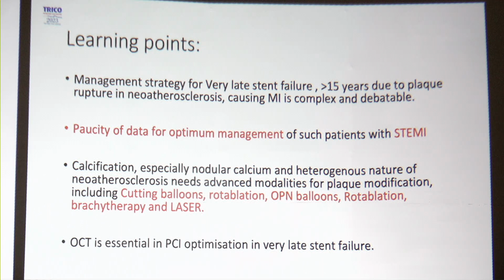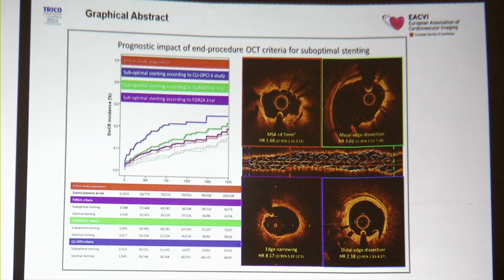And I think these two cases are important as far as this message is concerned: in any stent failure, imaging provides added information as far as management is concerned. Thank you for your patience.